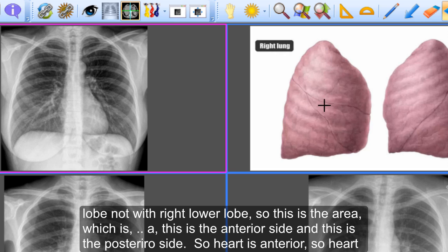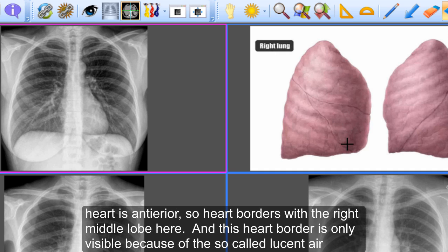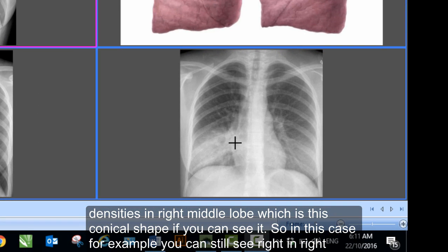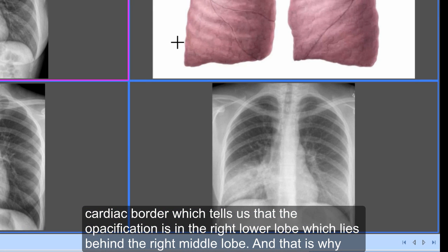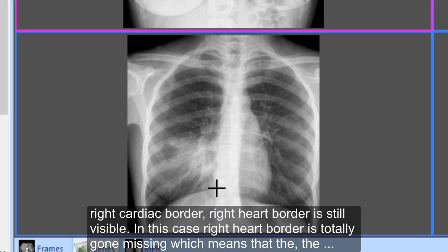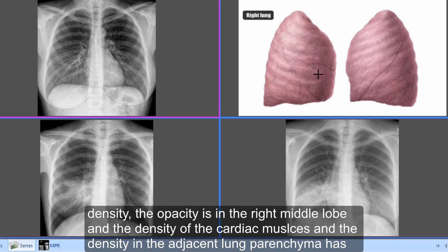The heart borders with the right middle lobe, not the right lower lobe. This is the anterior side and this is the posterior side — the heart is anterior, so it borders with the right middle lobe. The right cardiac border is only visible because of the lucent densities in the right middle lobe, which has this conical shape. In this case, you can still see the right cardiac border, which tells us the opacification is in the right lower lobe, lying behind the right middle lobe. In the other case, the right heart border is completely gone, meaning the opacity is in the right middle lobe.